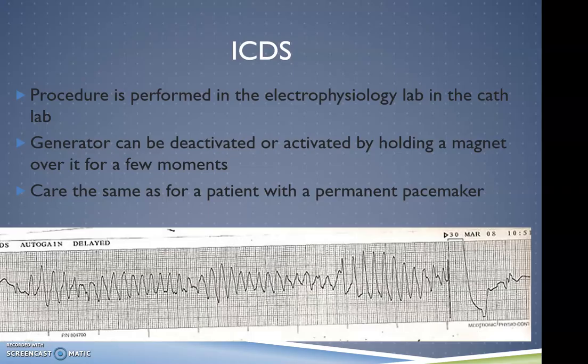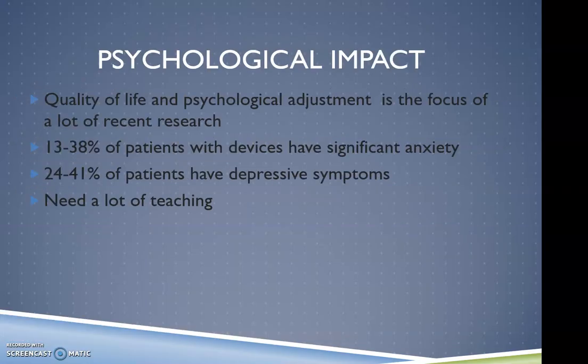They're for deactivating ICDs and pacers. Then when the patient comes out of the operating room, their ICD can be reactivated by holding the magnet over it again, but it really should be interrogated by a rep to make sure that the settings that are supposed to be on it came back as they were previously set.